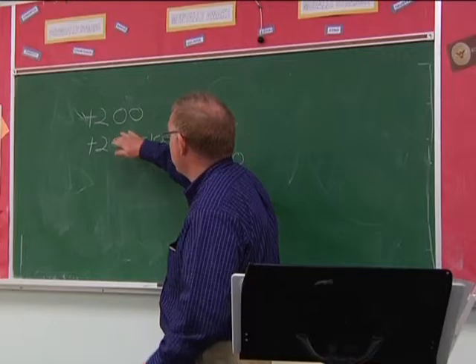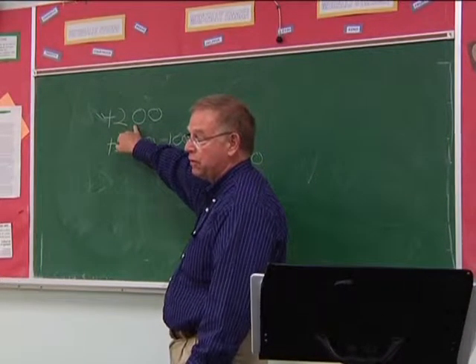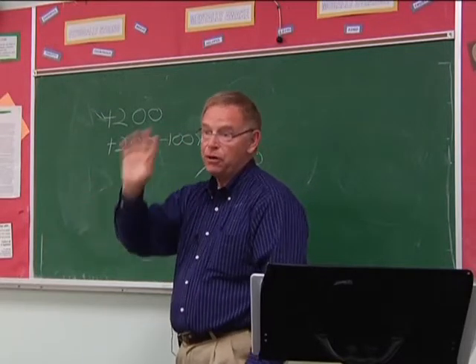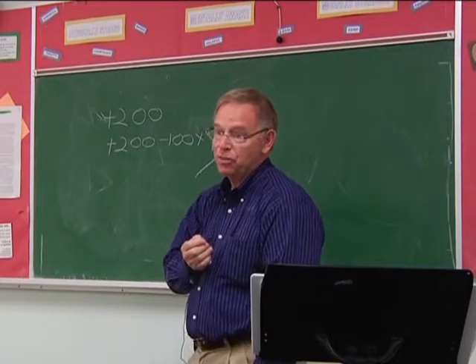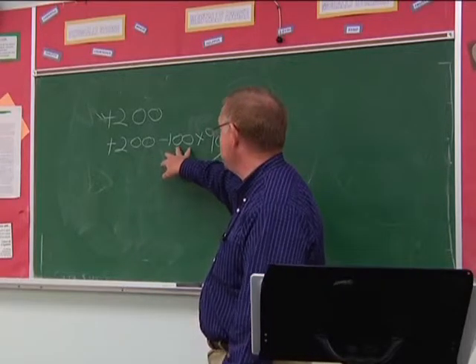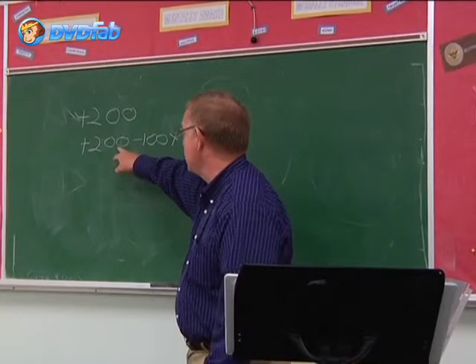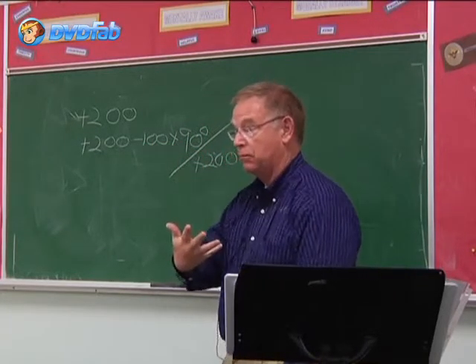So a single vision lens might be a +2. What 2 purposes might this +2 serve? It could be for 2 different patients. One patient, it could be for what? For reading or farsighted? Yes, it could be for hyperopia for distance, or it could be for presbyopia for near. It's exactly the same lens. A +2 is a +2. And then this means the patient needs a +2 with an astigmatism correction. And this means a +2 -1 axis 90 for distance and a +4 -1 axis 90 for near.